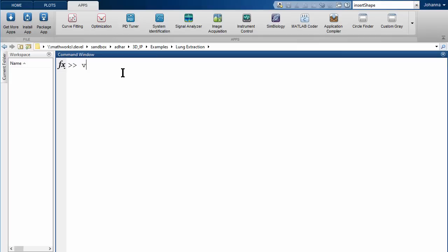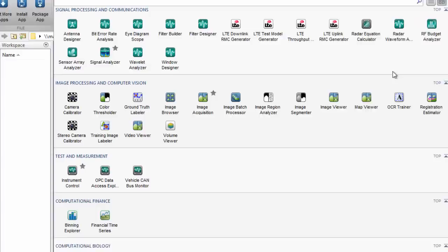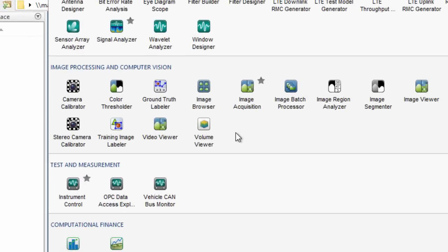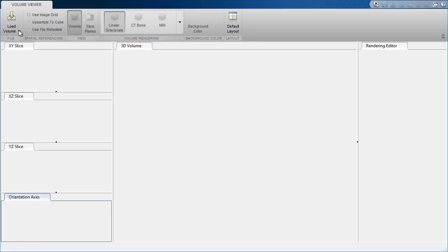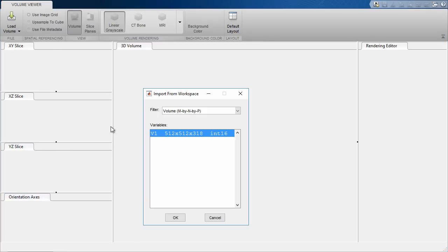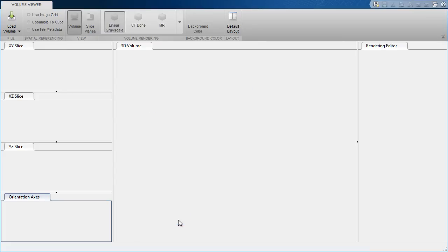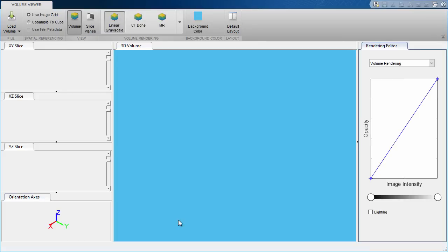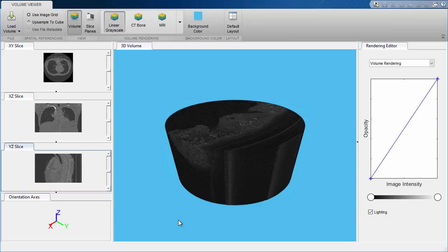The Volume Visualization app, or Volume Viewer for short, can be accessed through the command line or the Apps tab. You can load in a volume and then view it, hence its name. Typically these volumes are made up of stacks of 2D images such as DICOM, which is a common medical image format. You can easily import DICOM and other 3D data into MATLAB.